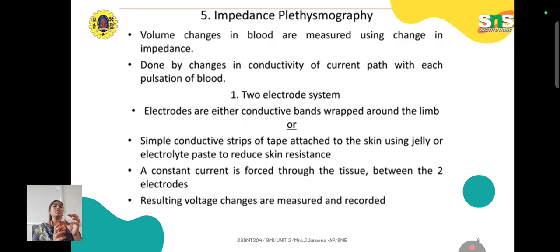Right. So as I said before, plethysmography is all about recording the volume changes in the blood with the help of change in resistance. These two are interlinked. By means of the device we are going to assess only the change in resistance. We should know how this change in resistance relates to volume changes; that is the actual area of interest that we have to get to know.